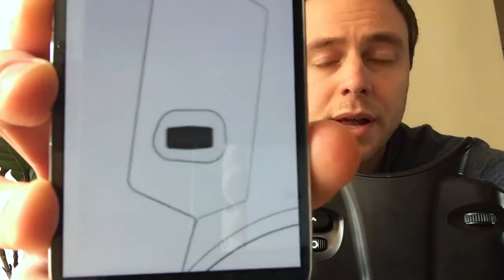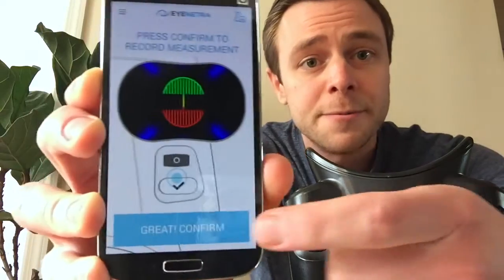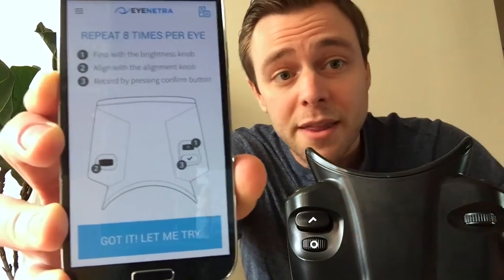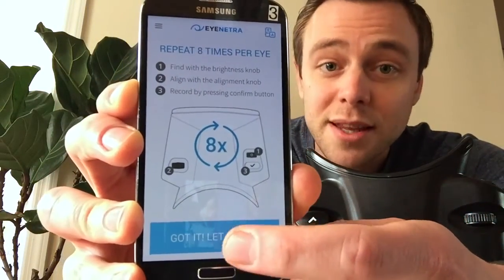Then you just click the selection button to lock in your response. Three simple steps: right first, then left, then click. Right for bright, left to align, then click.